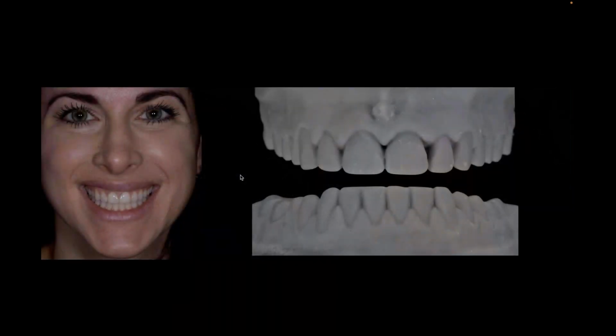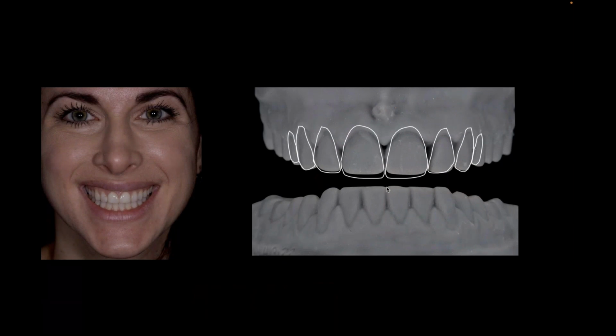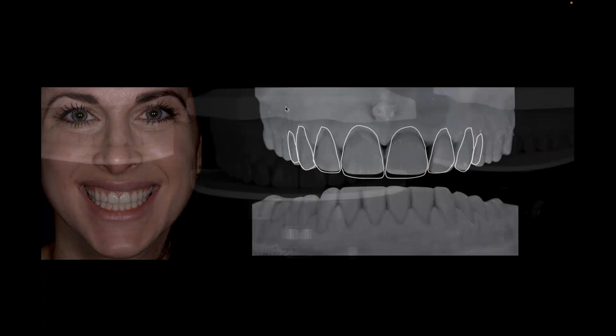So we'll look at her teeth. We'll decide that we might want to lengthen that incisal edge a tiny bit. That's where we're thinking we'll get a little more incisal edge position, but really what we want is to bring the gum line up. I'd like to get a little more out of her gum, especially on the 8 and 9, but definitely on the 3, 4, 5, and the 12, 13, so I could balance out that smile a little more for that big smile.